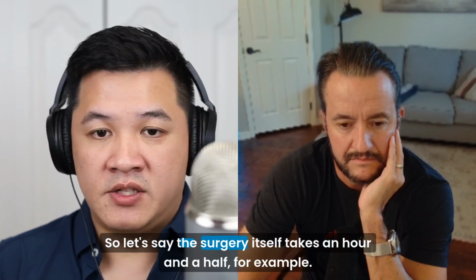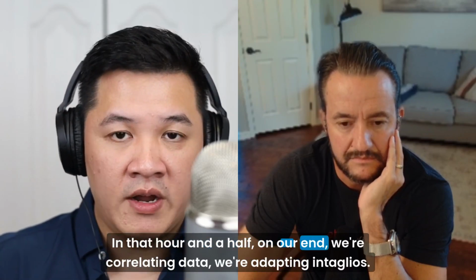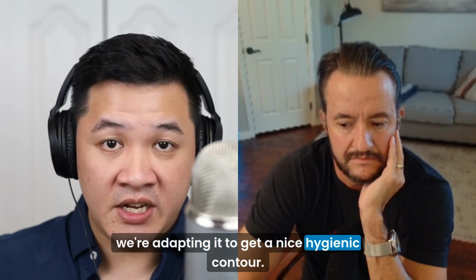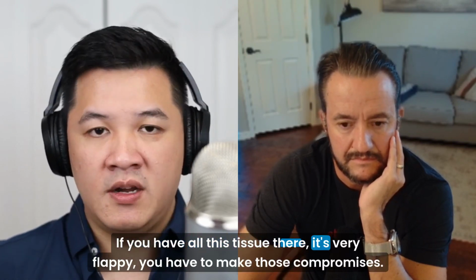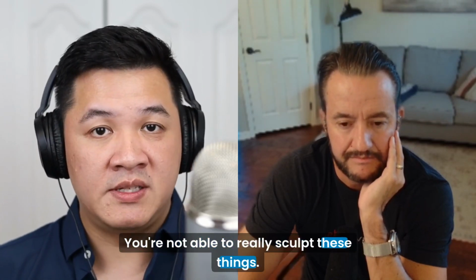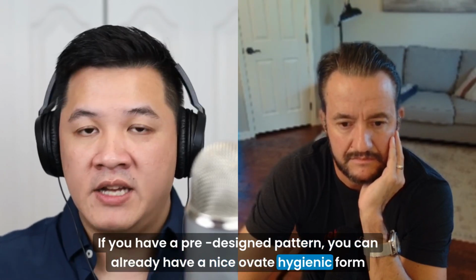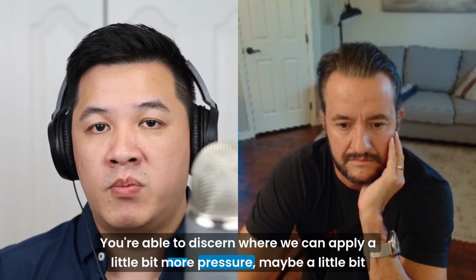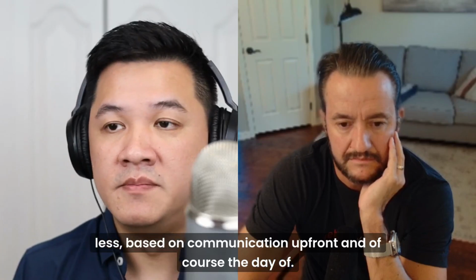So let's say the surgery itself takes an hour and a half, for example. In that hour and a half, on our end, we're correlating data, we're adapting intaglios, we're adapting it to get a nice hygienic contour. Again, that's another benefit. If you have all this tissue there, it's very flappy, and you have to make those compromises. You're not able to really sculpt these things. If you have a pre-designed pattern, you can already have a nice ovate hygienic form there. You're able to discern where we can apply a little bit more pressure, maybe a little bit less, based on communication up front and of course the day of.